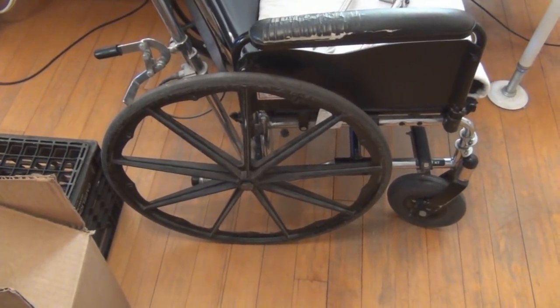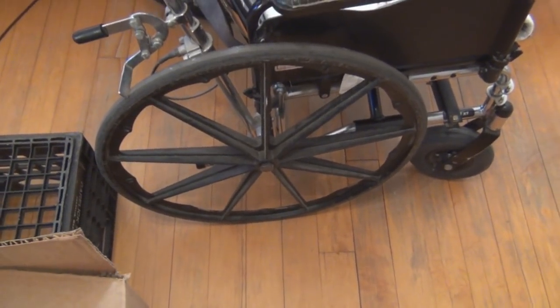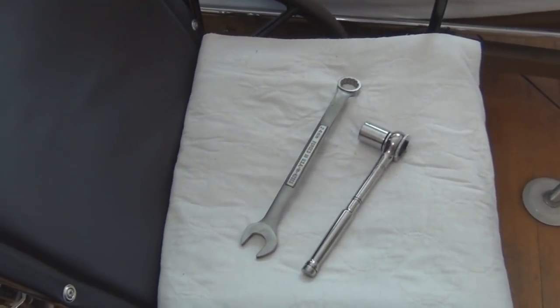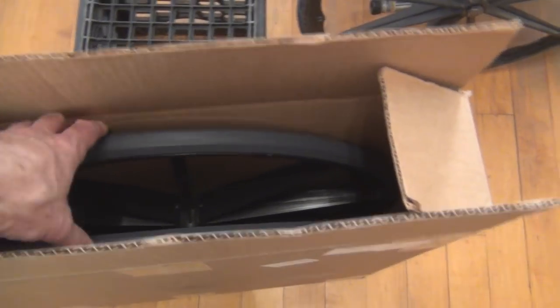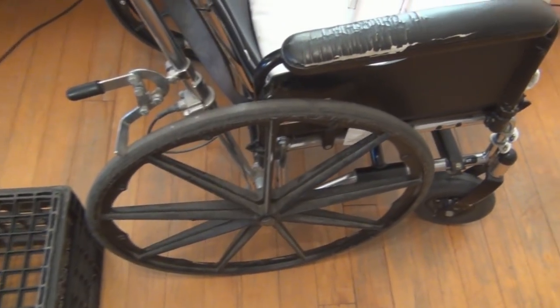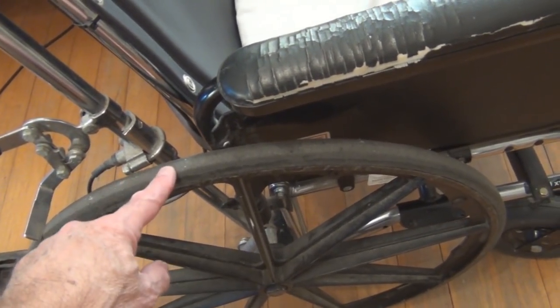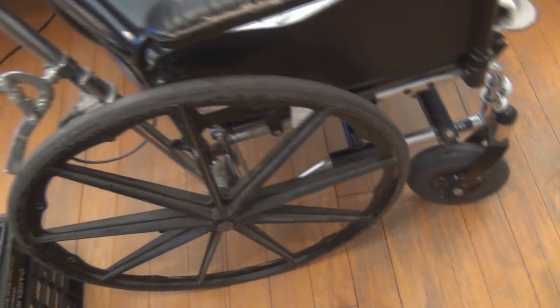I'm able to change these wheels pretty easily. I just took a look at what I need to do. I thought maybe I could just use one wrench, but I've got two wrenches and they seem to be working. Just the outside bolt comes off. These brakes really don't hold — there's so much material removed from the rubber on these that the brakes really don't secure.